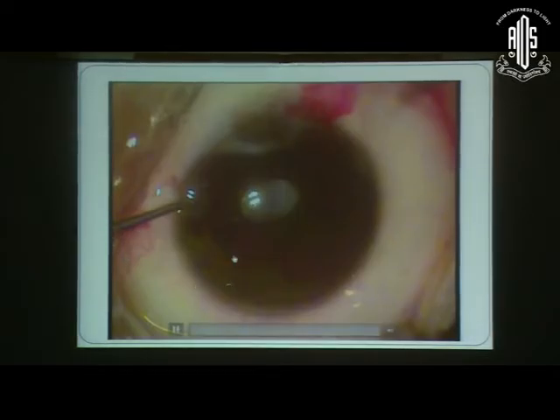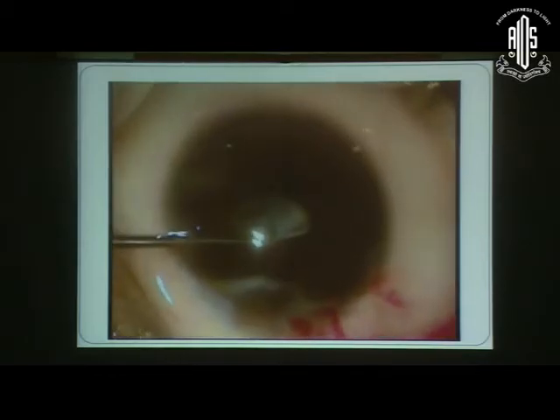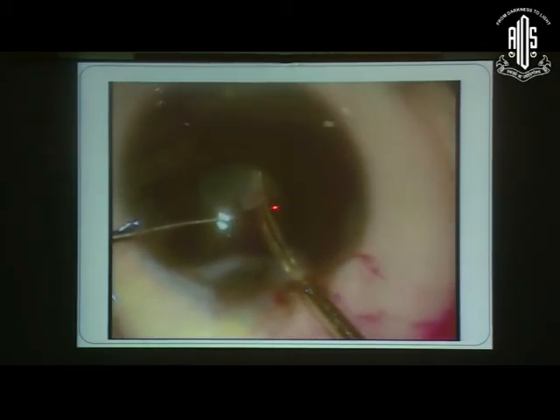Okay, secondary membrane formation. You would often come across such instances, especially in a young child where an IOL has been implanted. We do not know whether PC-tomy was done, and the child comes to you with a secondary membrane. So in such a case, you have to go back inside the eye. You have to reach behind the IOL, use a micro scissors, make nicks into the membrane.